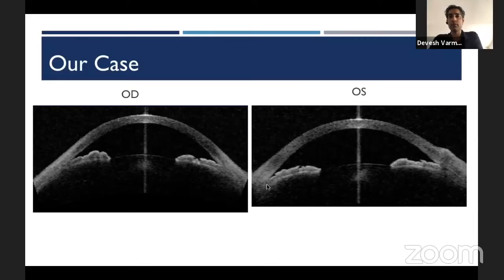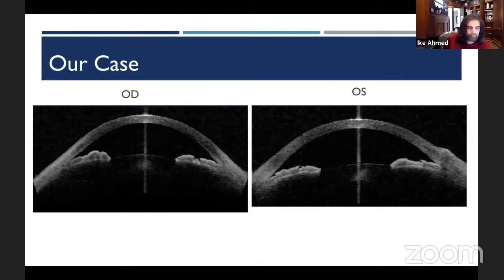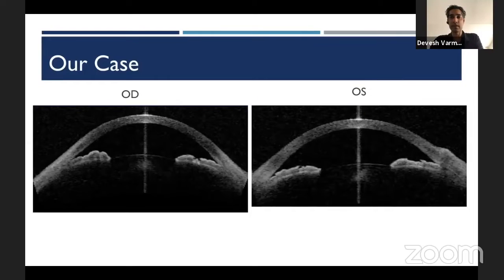Yeah, so I mean, this is a fantastic example. We often look at how to find scleral spur, and people show examples where it's really obvious. This is a real life example where, when the angles are closed, I find that sometimes the hardest to pick out scleral spur because everything kind of blends together and looks the same white. But here, these look closed, and I agree with where you pointed out on the left eye, the leftmost side there. That's probably the easiest spot to find scleral spur. But knowing where it is there, you can kind of deduce it for the same scan, left eye, the right side of that scan, and then you can kind of deduce that the right eye is totally closed.